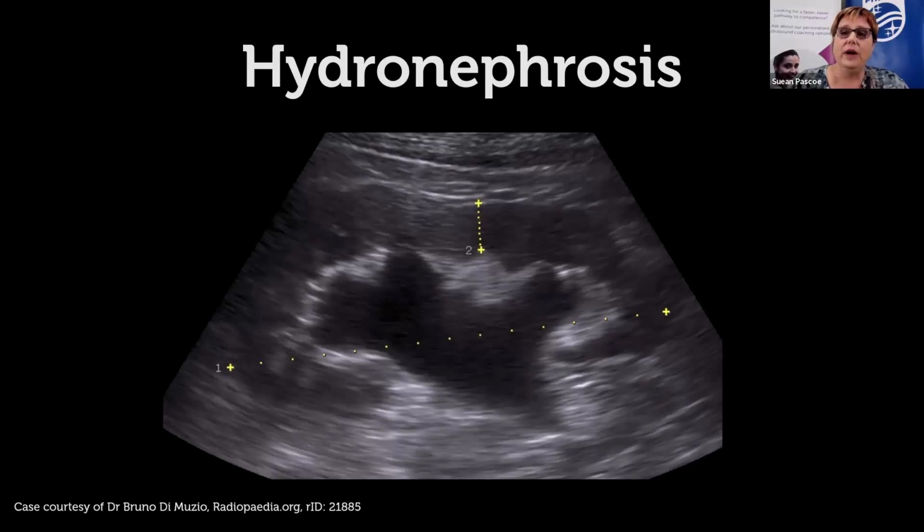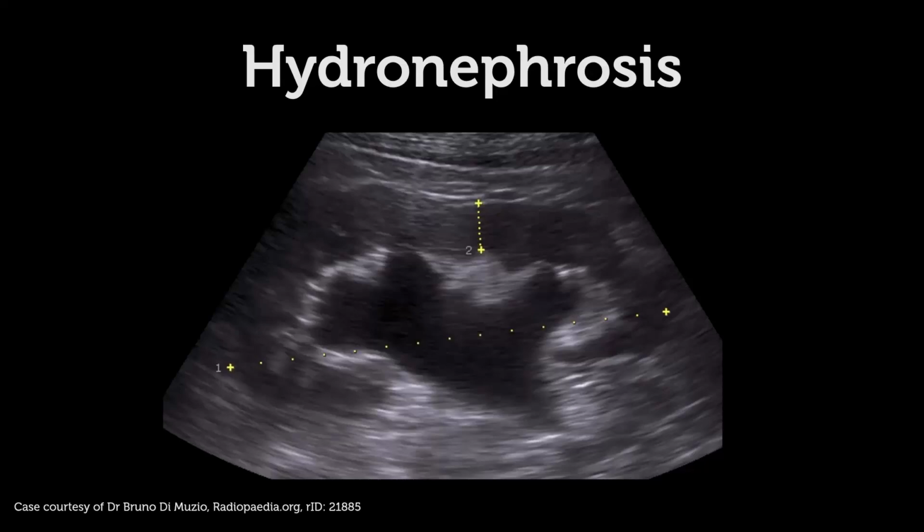So typically when patients are examined in the imaging department, we ask them to come with a full bladder, and then we examine the bladder and we look at the bladder wall and make sure there's no nasties hiding there or any stones or thrombus or anything sitting in the bladder. We also use the full bladder to have a quick look at the uterus and the prostate. And then we measure the volume.